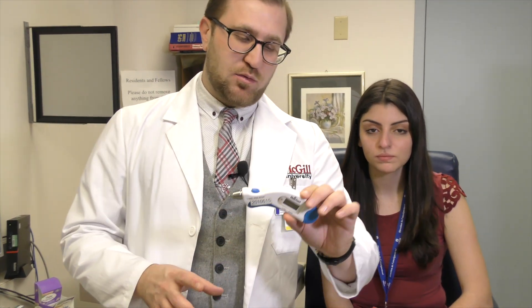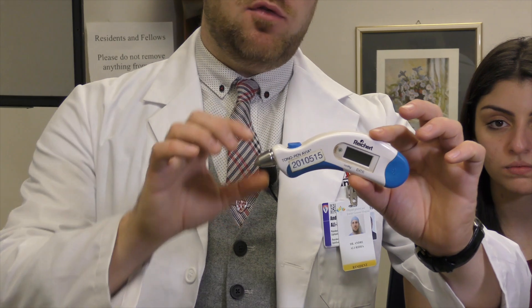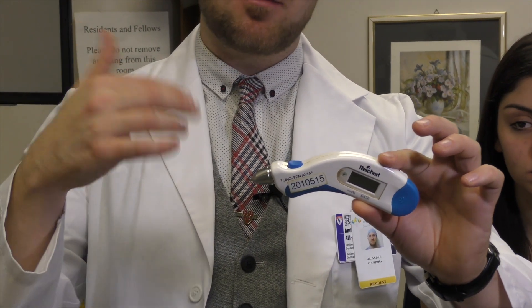To begin, I'm going to explain how you calibrate the tonopen and get it started and ready for testing. This is the Reichert Tonopen Avia. What you do is click the button here. If you hold down the button or click it twice, it will calibrate the machine. It's good to calibrate if it hasn't been calibrated for a while.